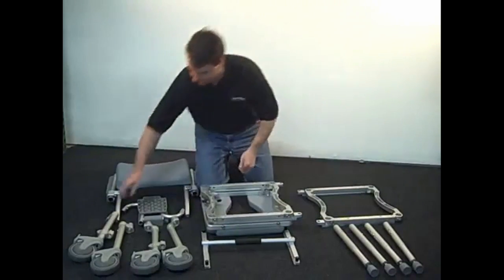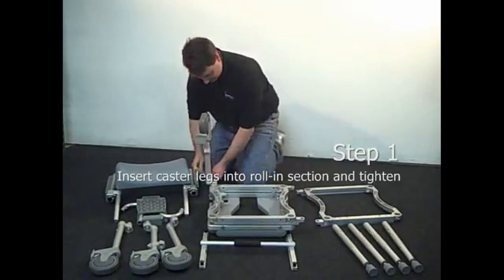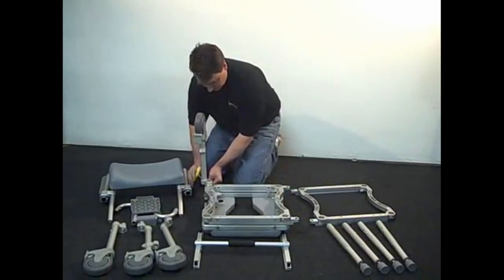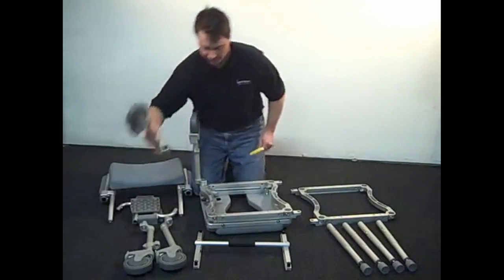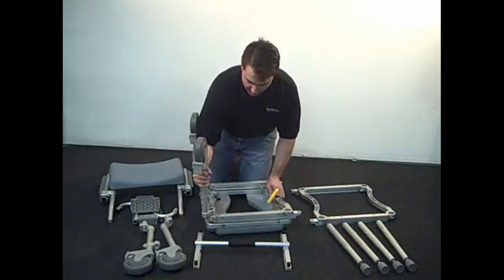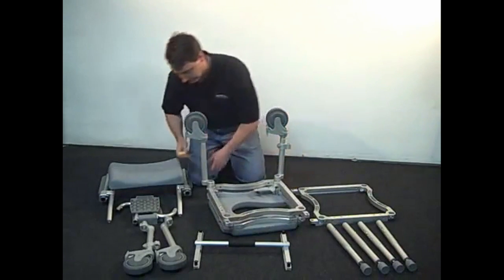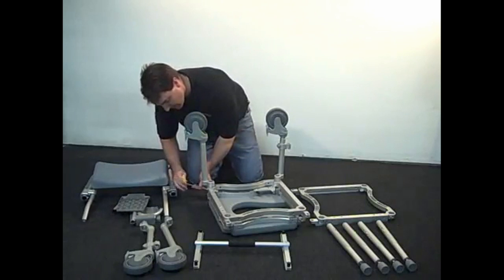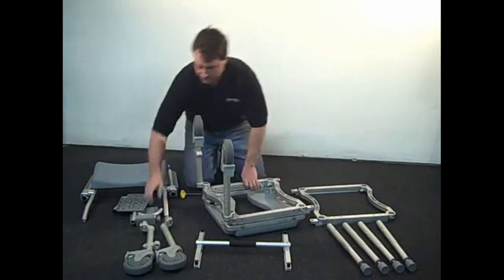Note the legs with the footrest clamps are the front legs and should be on the same side as the commode slot on the cushion. All four legs have offset elbows that should be positioned at a 45 degree angle relative to the frame. There is a small stainless steel pin on each of the offset pieces that mates with the frame. Lock the legs into place by using the included T-handled Allen wrench to tighten the bolts located in the corner of the frame.